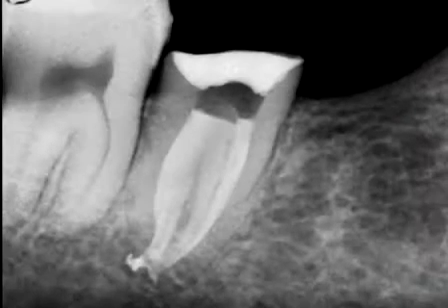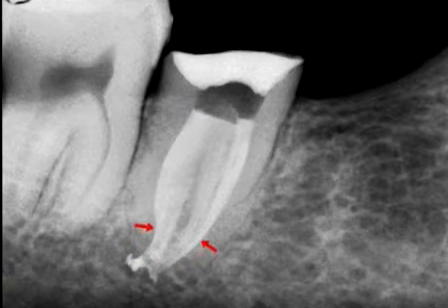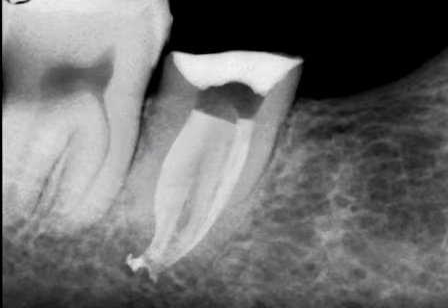Certain teeth, like this C-shaped molar, may require that the apical foramen be finished to a size 40 or 50. The clinician should create shape coronal to the radiographic terminus to provide resistance form to hold gutta percha and eliminate the potential for packing overextensions.